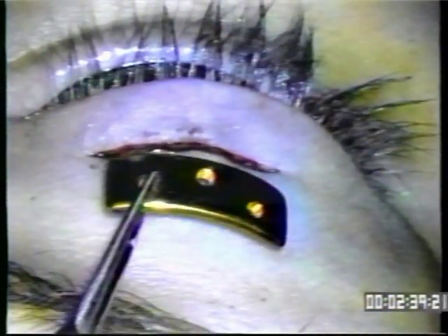It will give you the most acceptable cosmetic result. The other thing you want to do is to dissect between the cartilage and the orbital septum superiorly. The gold will fit along the soft tissue connection to the tarsus inferiorly and between the tarsus and the orbital septum superiorly.